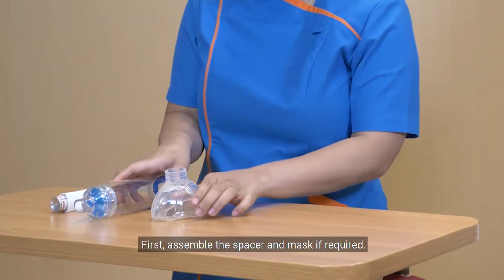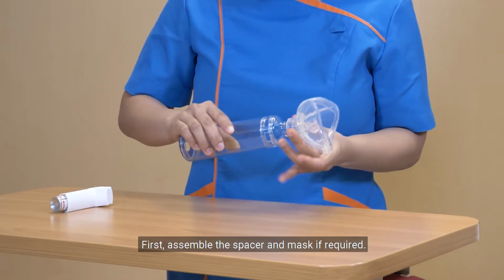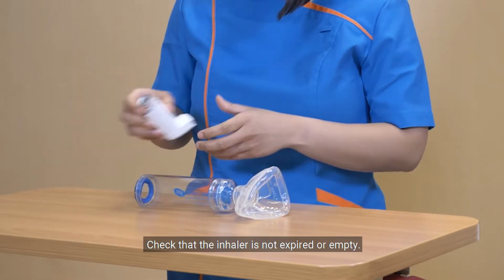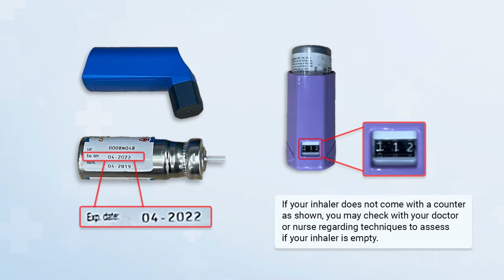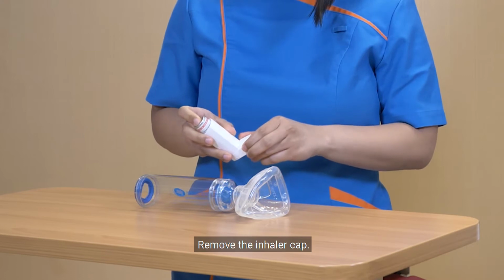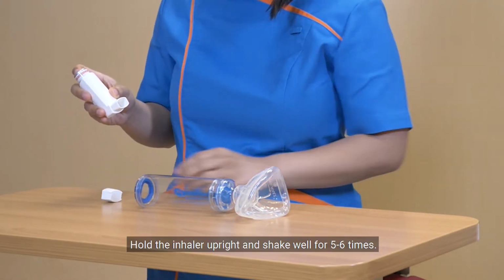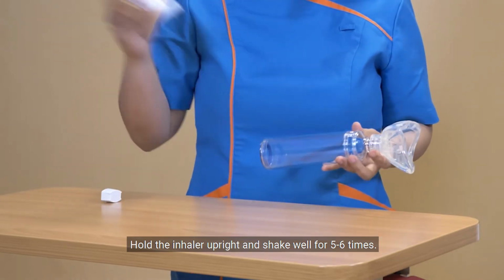First, assemble the spacer and mask if required. Check if the inhaler is not expired or empty. Remove the inhaler cap. Hold the inhaler upright and shake well for 5 to 6 times.